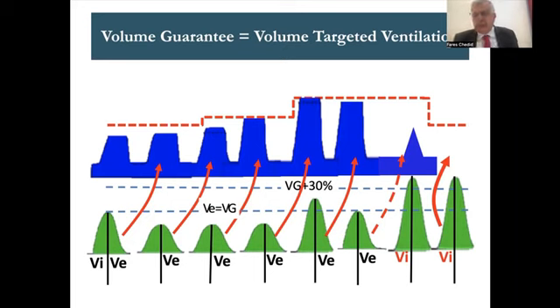That's a pressure dump. But even if the pressure has been dumped, maybe the baby will still take more. And then at the next breath, again, he took more than the volume guarantee by 30%, and the pressure was dumped and the expiratory valve opened. This is the principle of volume guarantee.